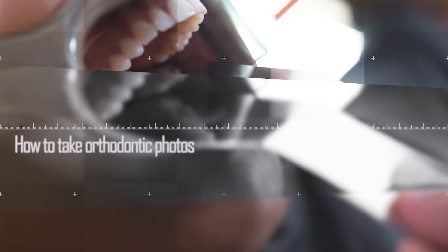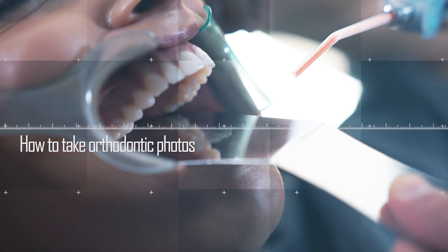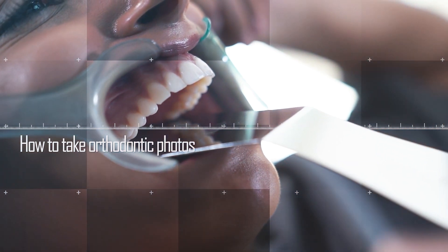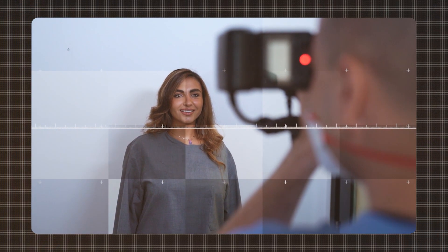Clinical photography is an important part of orthodontic full records. They serve as a reference point for both the patient and the dentist, marking the starting clinical representation for the patient. However, they play an important role in treatment planning orthodontic cases, including aligners.